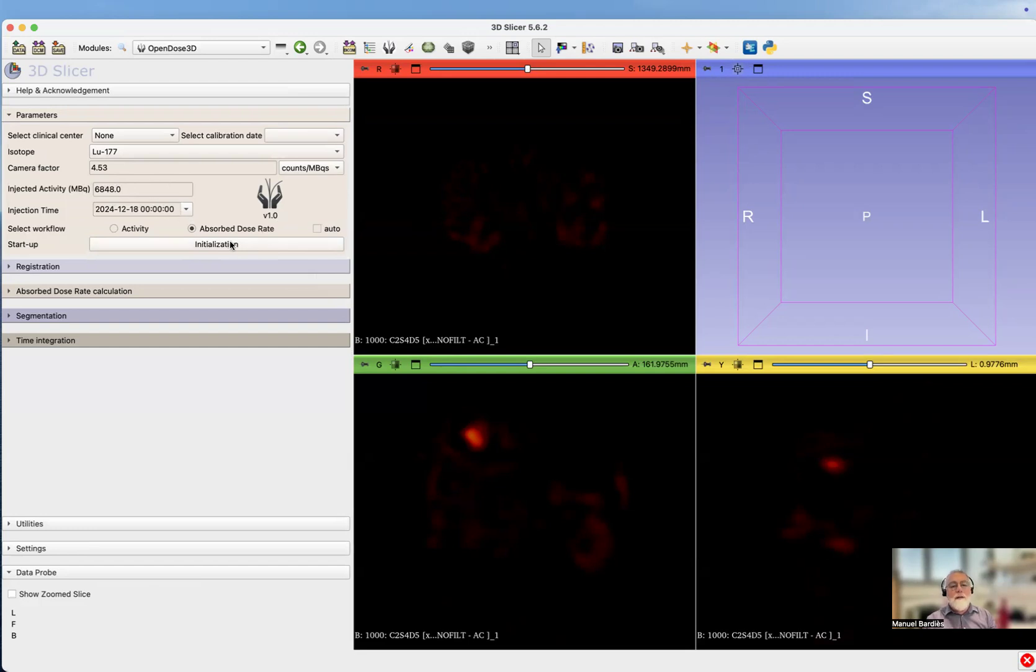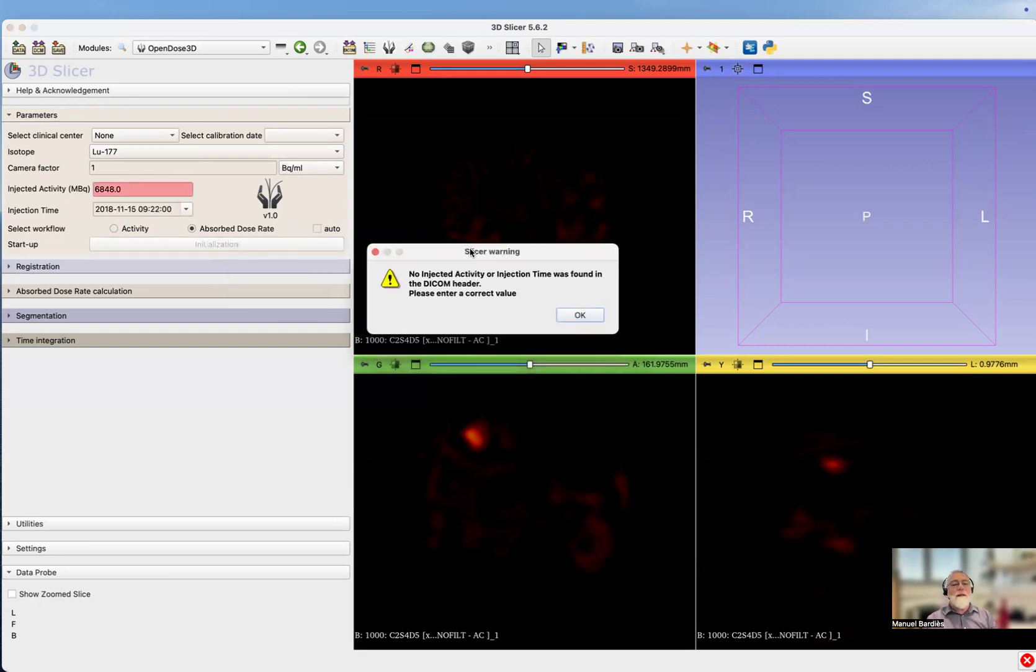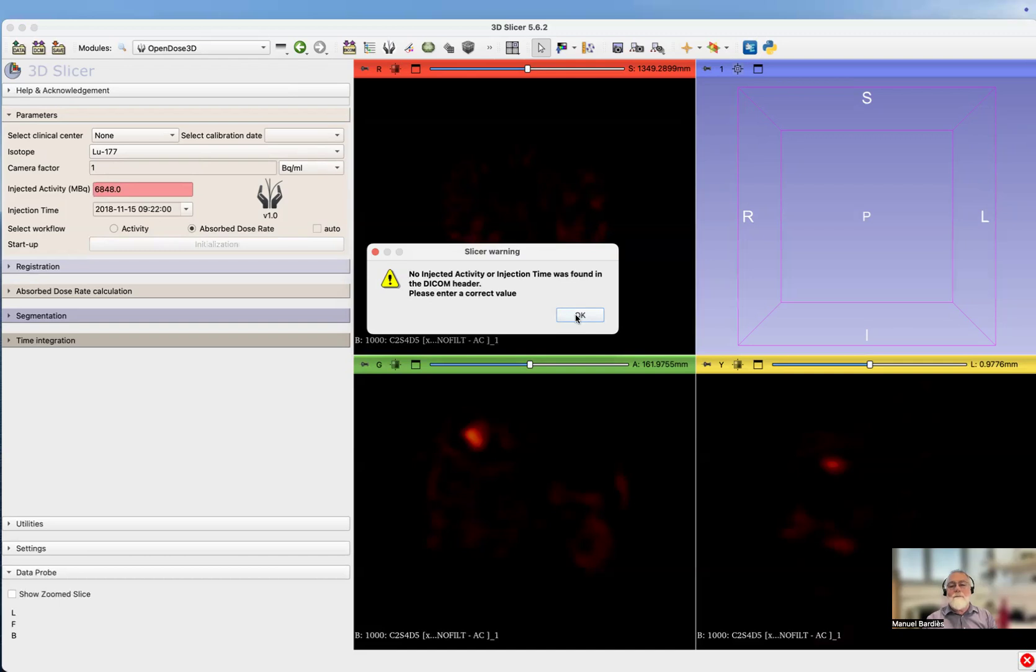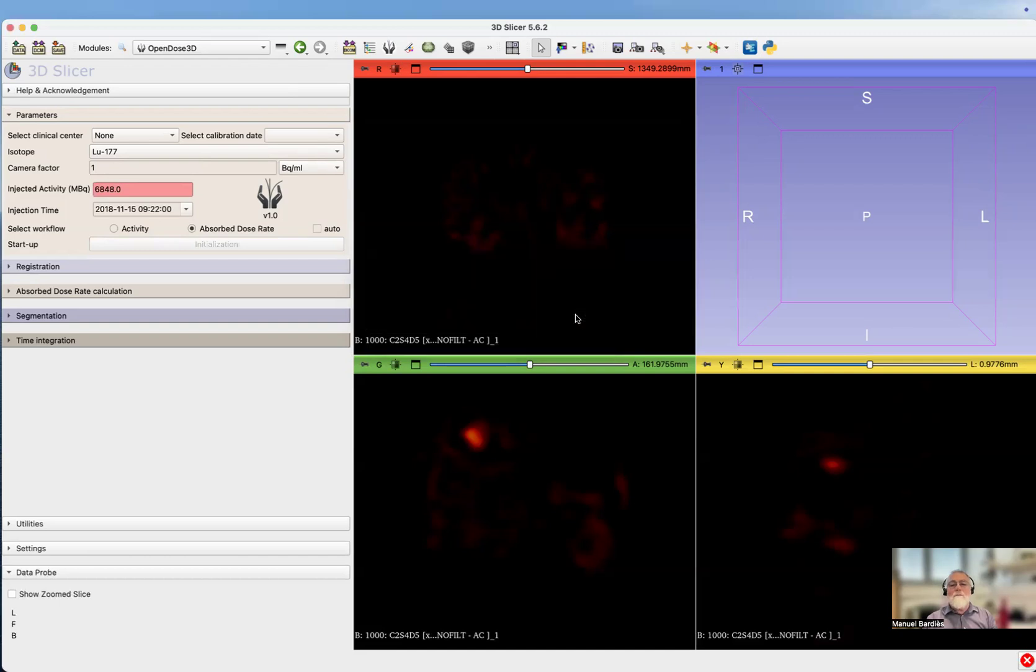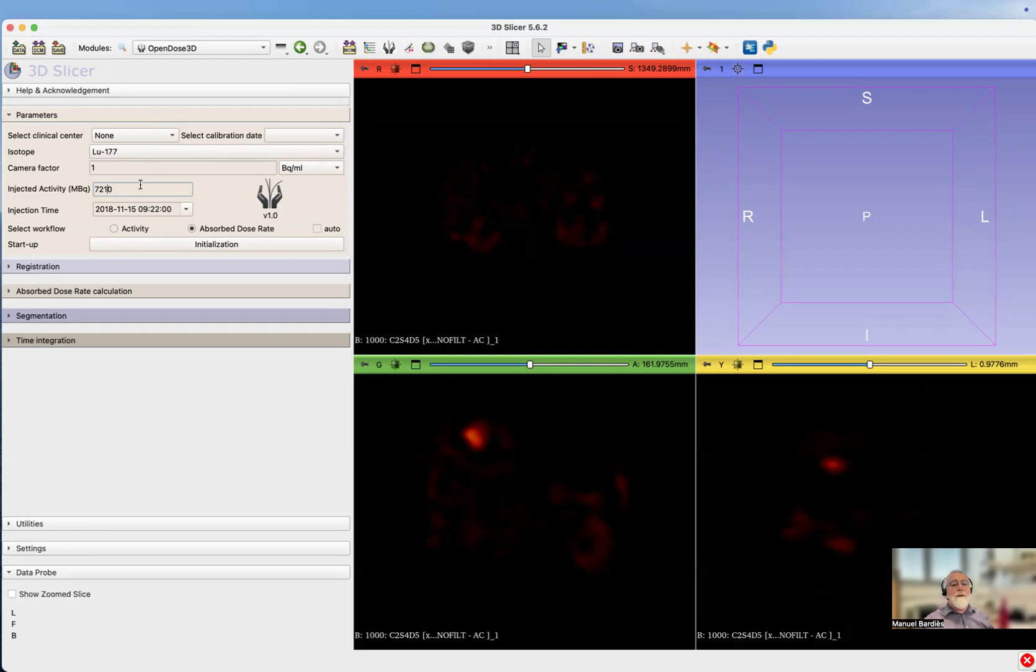If you click initialization, there is something wrong. No injected activity or injection time was found in the DICOM header, please enter a correct value. I've been downloading the file that informs the administered activity in that specific patient. I know it is 7.2 gigabecquerel, and now I can launch the initialization process.